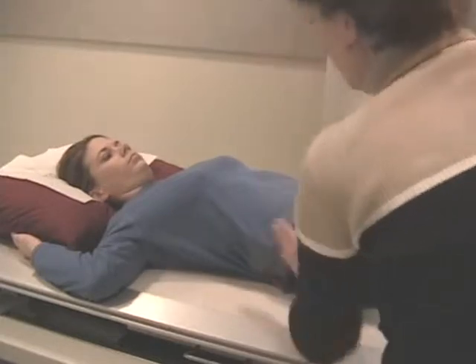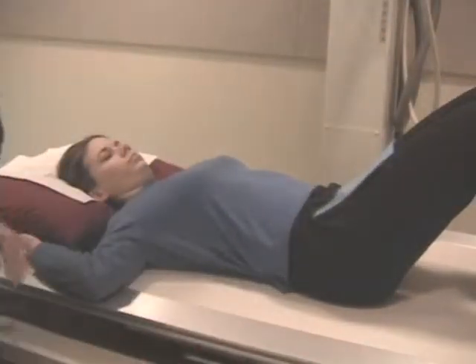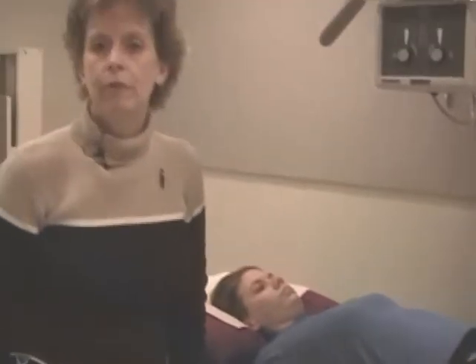Okay. We've centered the film at the level of L3, the third lumbar vertebrae, which is 2 inches above the iliac crest. That's with the philosophy that L1 through 5 should be centered to the film. Some of your clinical sites or your places of employment will want the entire sacrum on, and so on a national level you might find the centering right level with the iliac crest. That's to include the entire sacrum and coccyx. So again, you'll have to ask the philosophy of your department, and you may have to adjust the centering just a little bit. Most of our places, again, iliac crest is 2 inches below the center of the film.